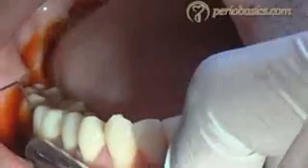Now the modified flap operation was introduced by Kirkland in 1931. This is one of the most conservative procedures which preserves the healthy tissue because it aims only at removal of the pocket lining. This is why this procedure is done most commonly on the maxillary and mandibular anterior areas because they are of prime aesthetic concern. So now let us see how a modified flap operation is done.